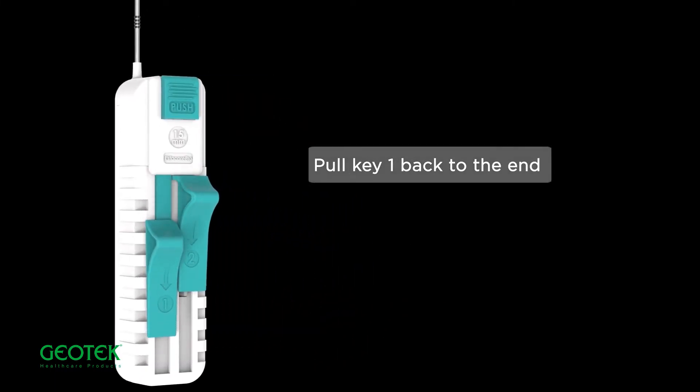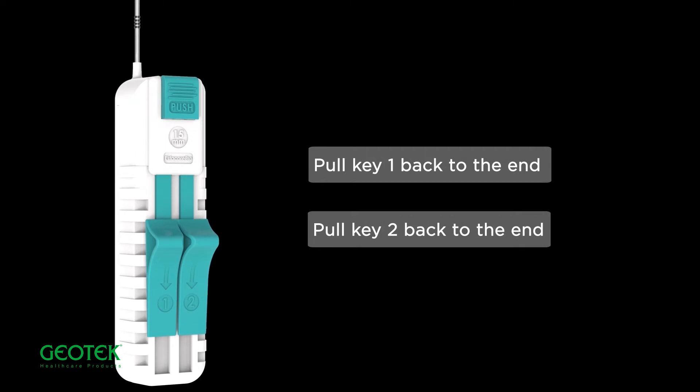Pull Key 1 back to the end. Pull Key 2 back to the end.